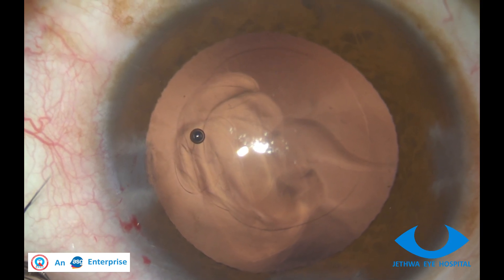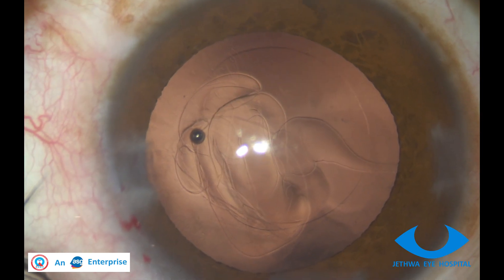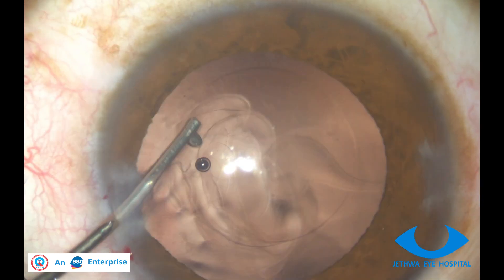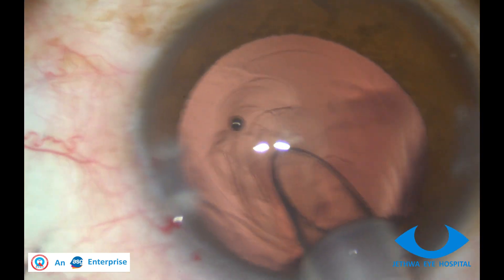Once we are sure that enough OVD is injected and the chamber is deep, we can inject the IOL in the bag.